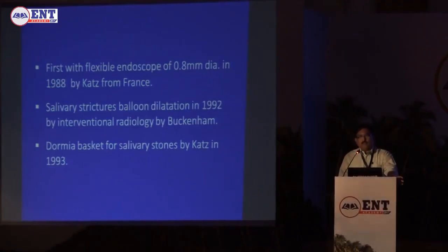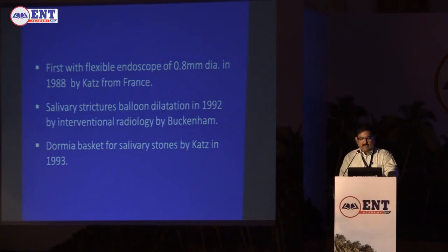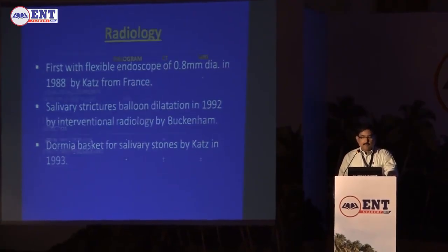The only thing is we should be thankful to two companies of the world. There is one more German company, I'll tell you the name. There are two German companies who now spearhead this salivary gland endoscopy. No, Olympus had flexible ones, they are no longer in the picture. Both are German companies, both are rigid and semi-rigid.